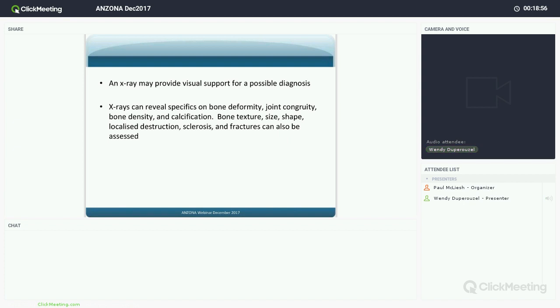However, there really is a scope for nurses, and particularly specialist orthopaedic nurses, to have a lot of knowledge and skills when they are looking at the plain films, so that the patients that we're managing, we can be providing them with better care. So what I will be doing is covering it in a way that continues to meet our scope of practice as nurses, and particularly encouraging you to pick up the more advanced practice skills of a specialist nurse.